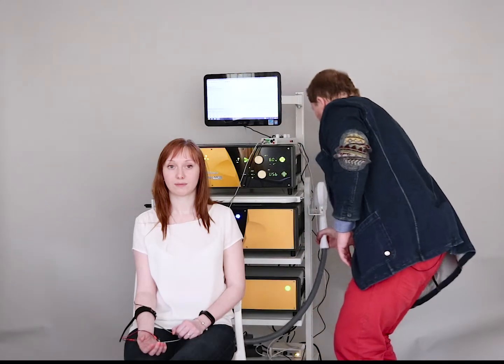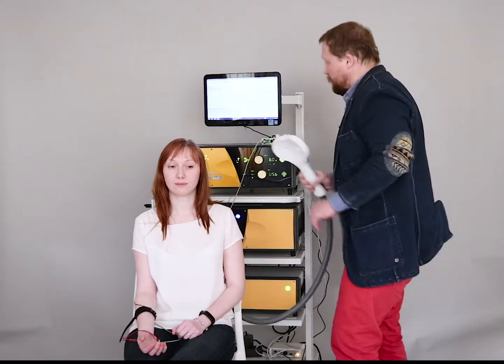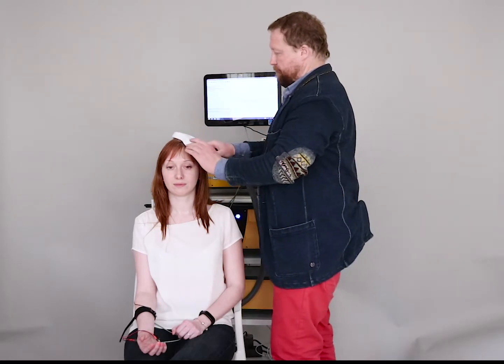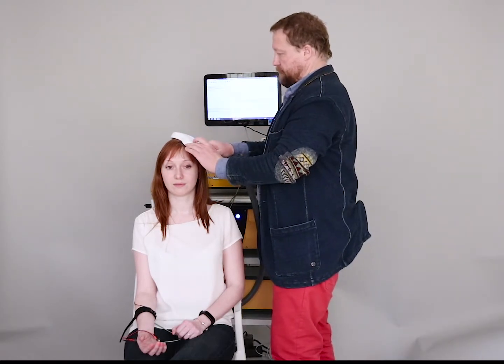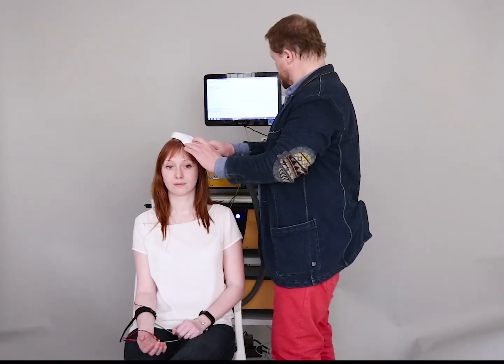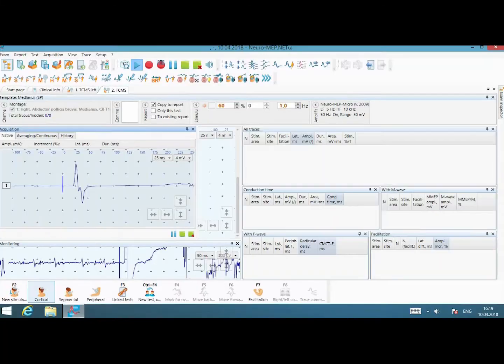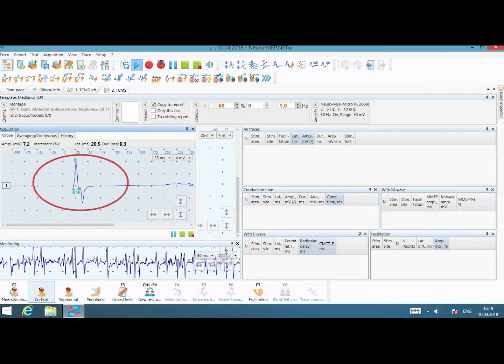Now I will deliver the stimulus. This is MEP.